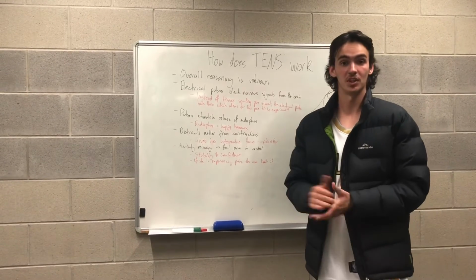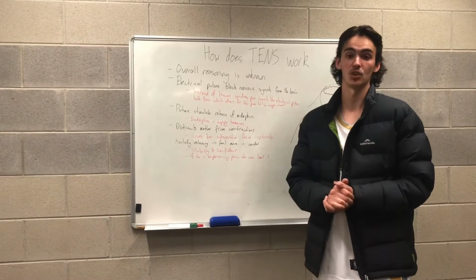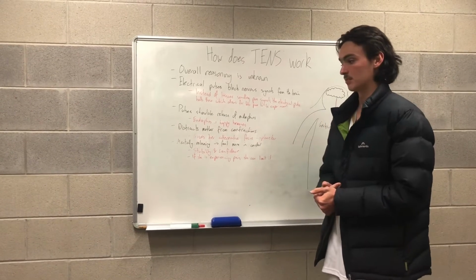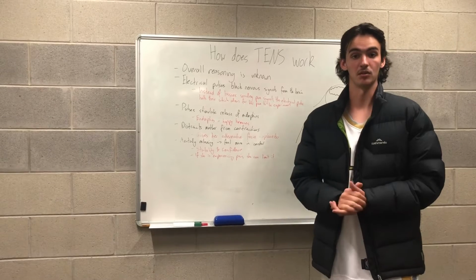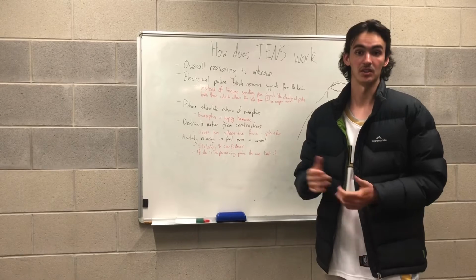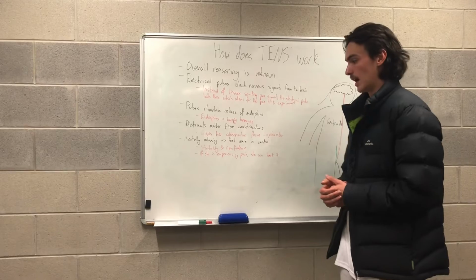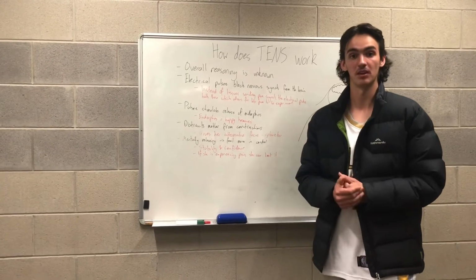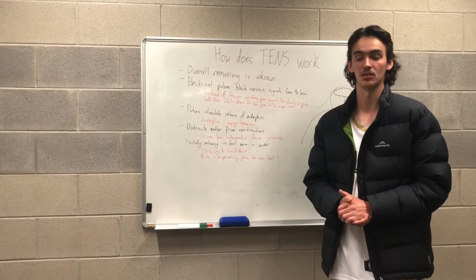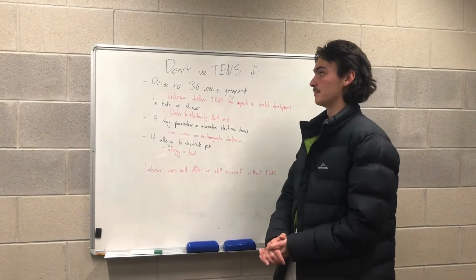Finally, it can also be mentally relaxing for the patient as they're able to feel a lot more in control of their labour. Having the buttons at the touch of your finger can provide a lot of stability and a lot of confidence in a lot of patients, as they have the ability to, like I said, control when they're able to use the electrical impulses. In doing this, if they are experiencing any type of pain, they again have the ability to limit that wherever possible.